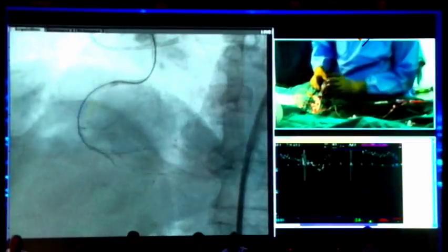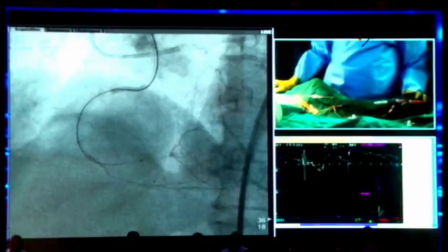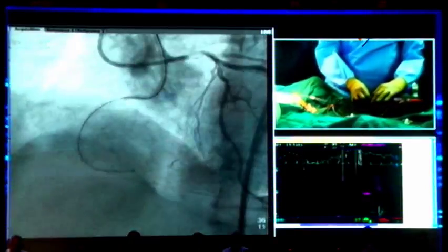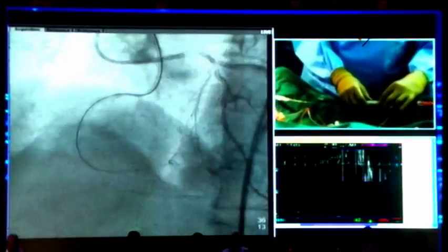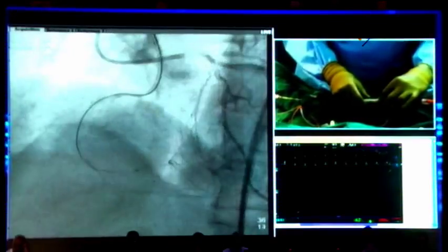Okay. I want you to reference that. Oh, it's going to be bloody hard. Oh, Arun, actually we missed you. You took the Cross Boss down. I'm going to show you again. Okay, hold on, please. I thought you were with me, to be honest. Sorry for that. No, it's all good.